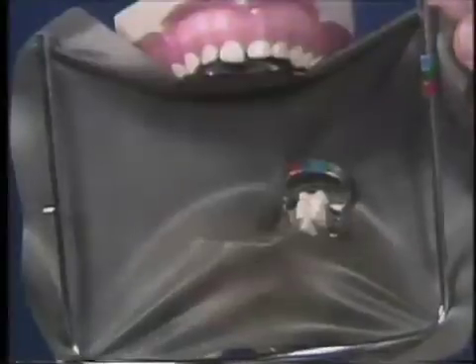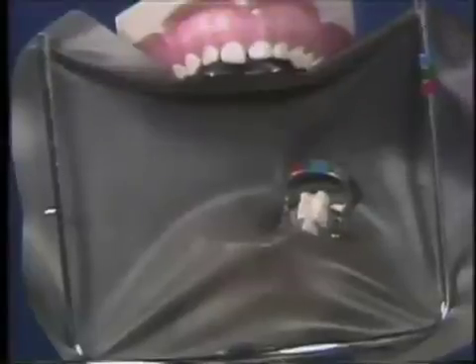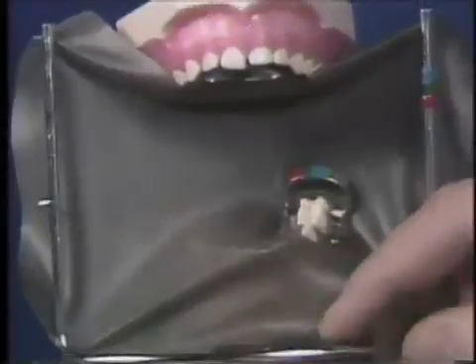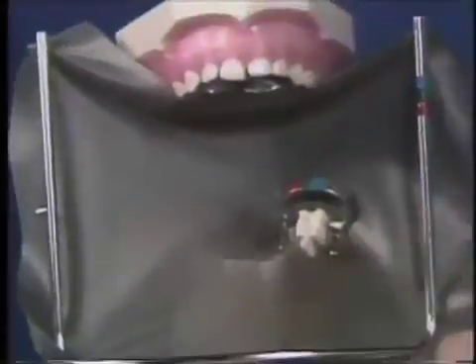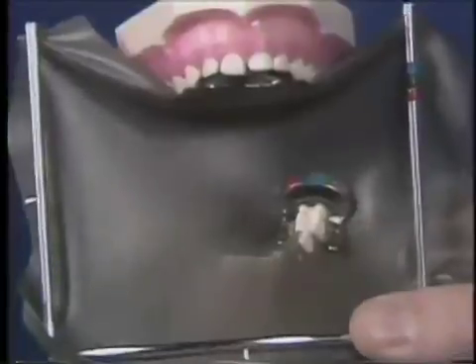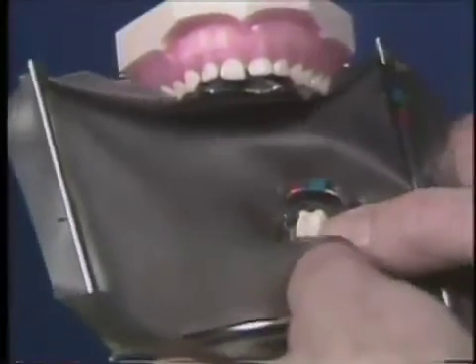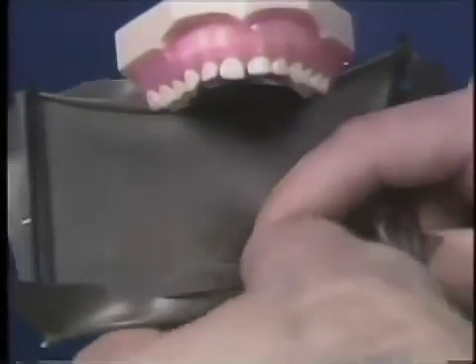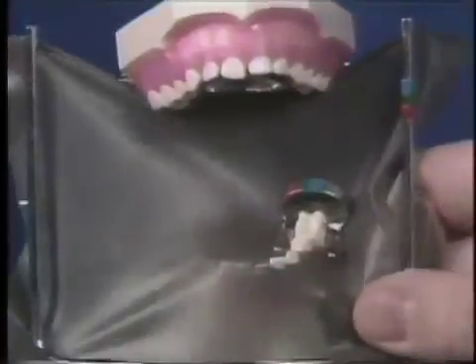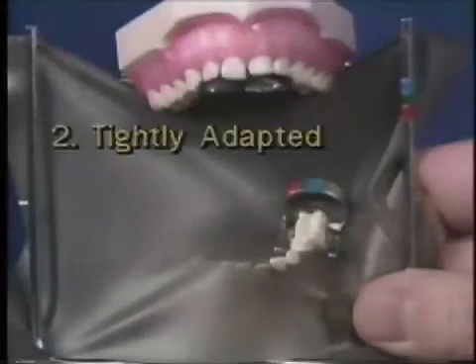The remainder of the rubber dam procedure is the same regardless of the way the clamp was placed. The rubber dam must be adapted on the other teeth and a dental floss ligature is tied. It helps if you pull the rubber dam anteriorly to cover the most anterior tooth to be isolated. At the same time, attach the rubber dam to the middle pin of the frame. Use waxed dental floss to force the rubber dam through the contacts between the teeth. Check that the clamp is stable and has not lifted up on the distal of the molar when you were stretching the rubber dam forward, and that the rubber dam is tightly adapted on the clamped tooth.